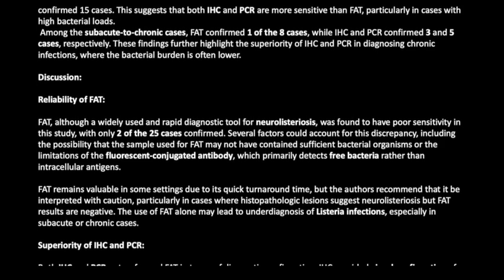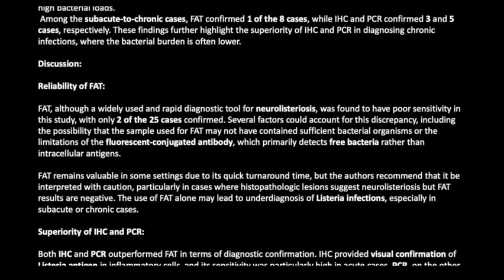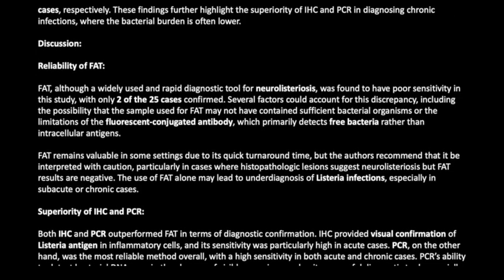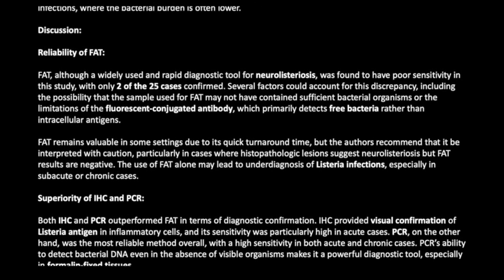FAT remains valuable in some settings due to its quick turnaround time, but the authors recommend that it be interpreted with caution, particularly in cases where histopathologic lesions suggest neurolisteriosis but FAT results are negative. The use of FAT alone may lead to underdiagnosis of Listeria infections, especially in subacute or chronic cases.